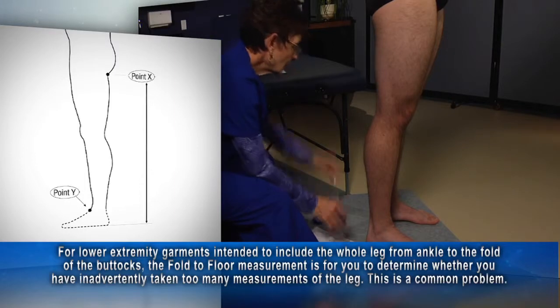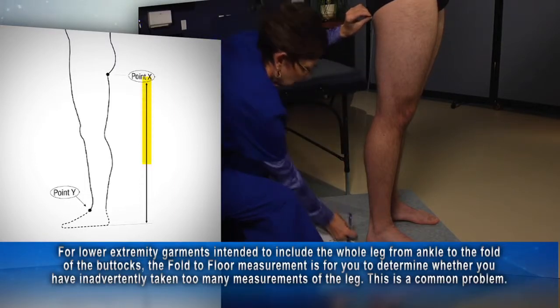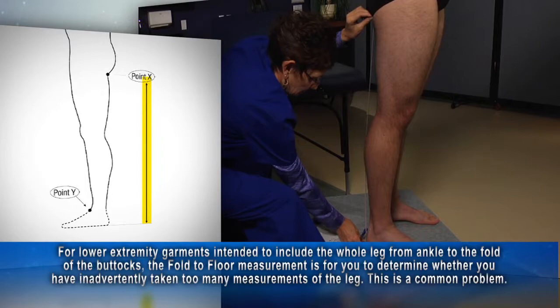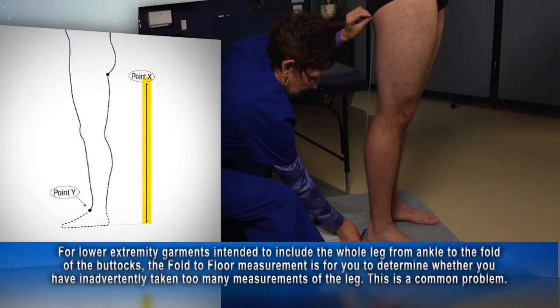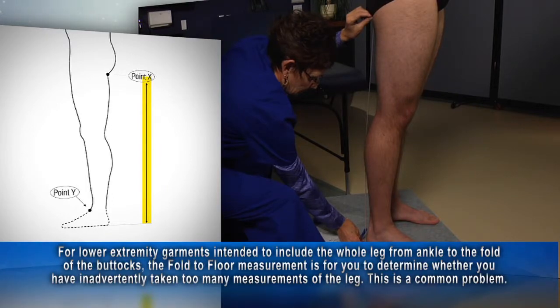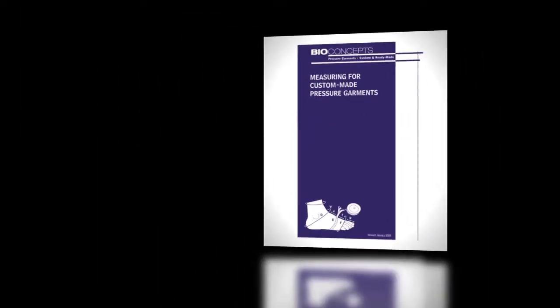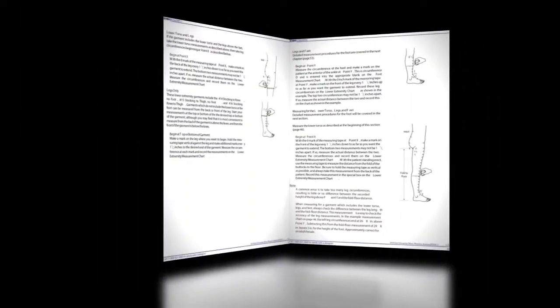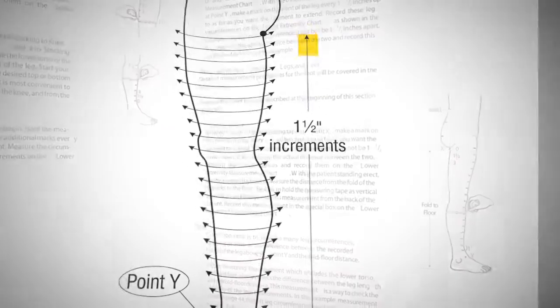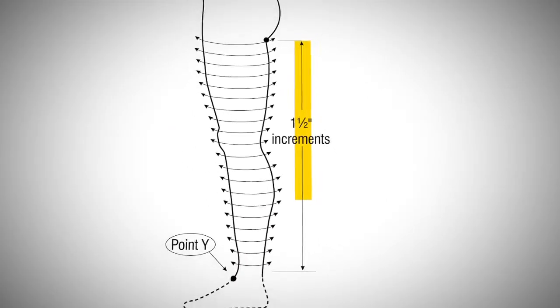With the patient standing erect, use the measuring tape to measure the distance from the fold of the buttocks to the floor. Hold the tape as vertical as possible and always take this measurement from the back of the patient. Refer to the manual for important information about the fold-to-floor measurement.